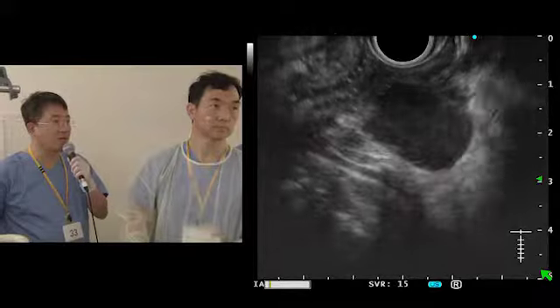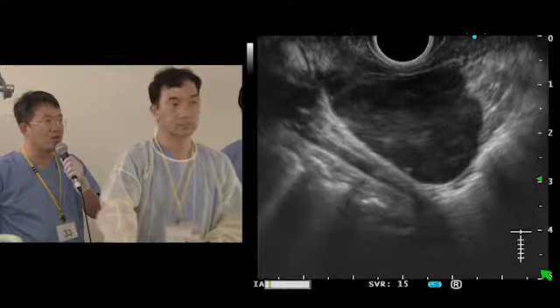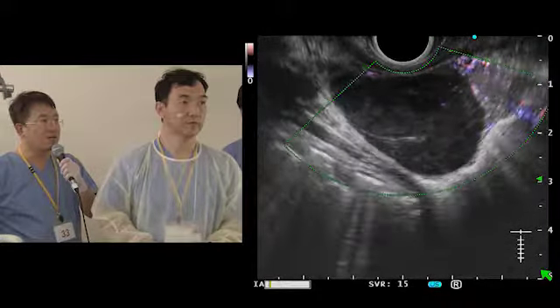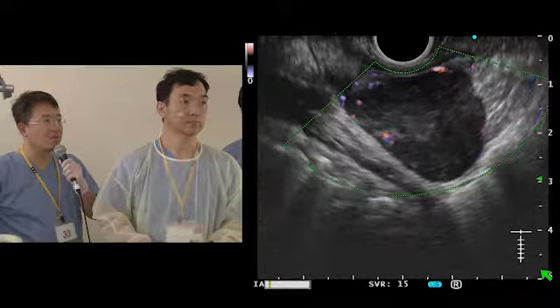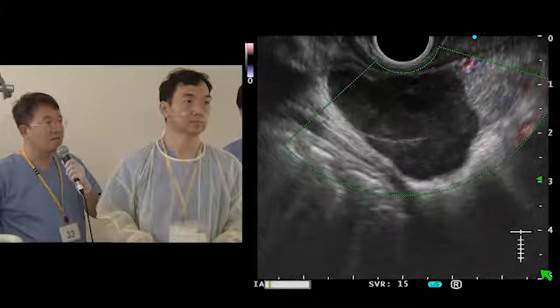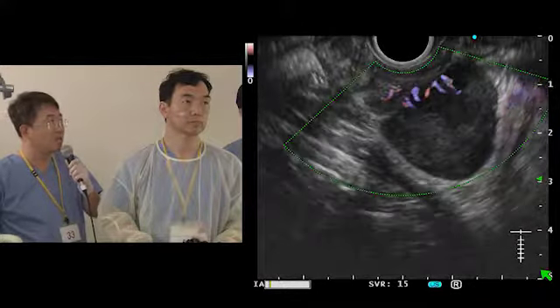But for this case, the esophageal growth is lobulated, the inside is a little inhomogeneous, and there is also vascularity. Some feeding vessels, yeah, we can see. So for this case, if he wants to refer to surgery, I think maybe we don't need FNA. But if there is some consideration, maybe today we have to perform FNB to get larger tissue.